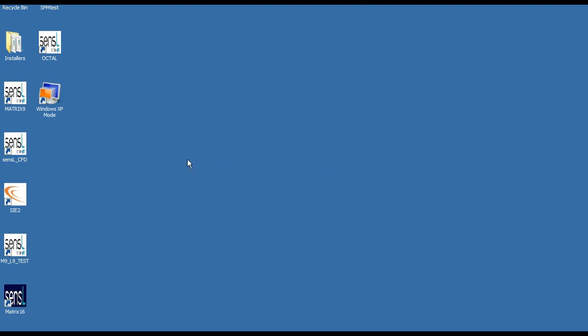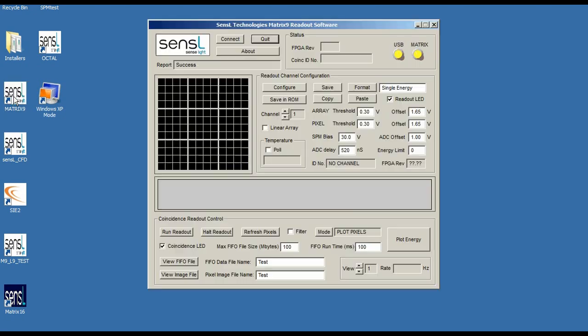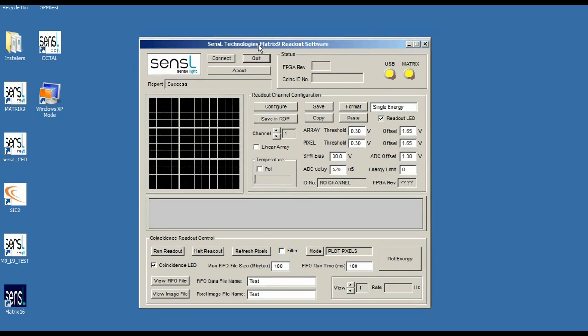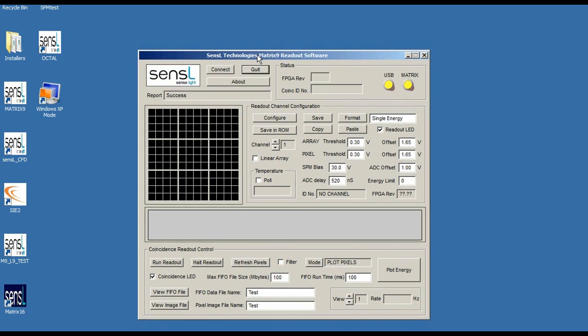Okay, in this video we're going to show you how we can actually do some curve fitting with the automatic curve fitting function in the Matrix 9 software. We've previously showed you how to connect a crystal to the detector to the array.